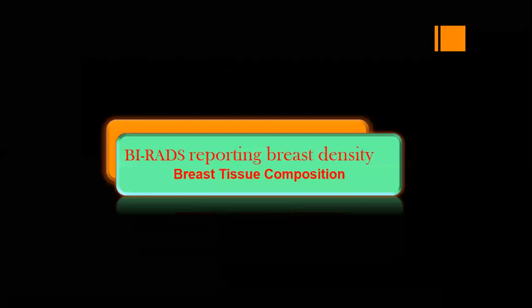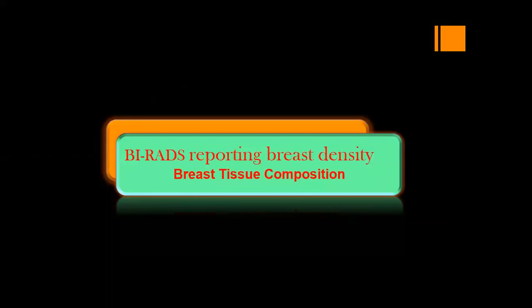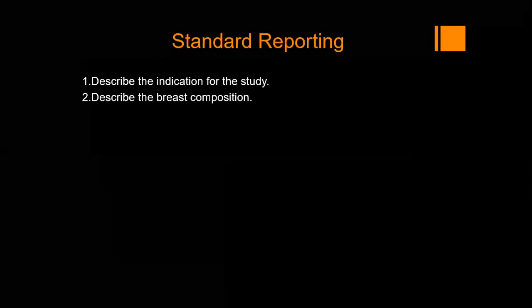Okay. After that, we make sure we have a good quality image. Then we have to comment on the breast composition.